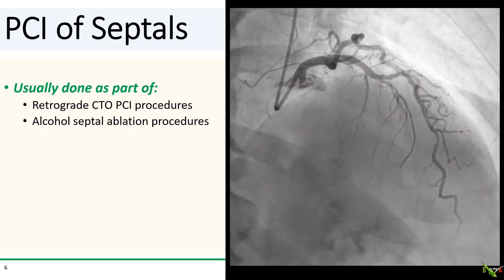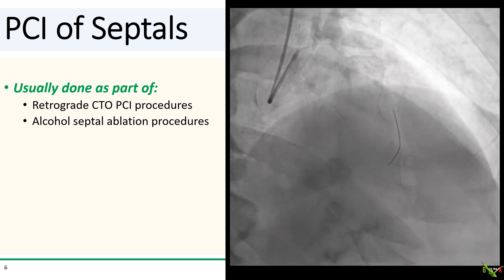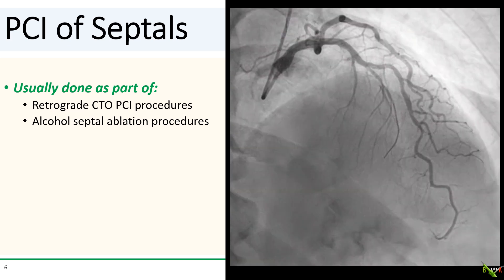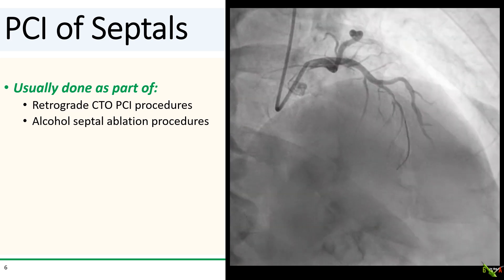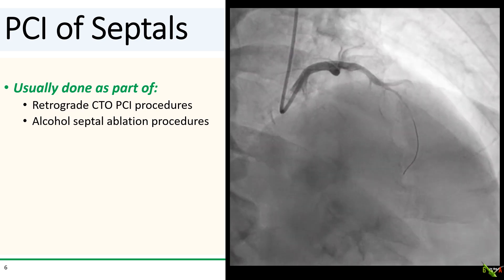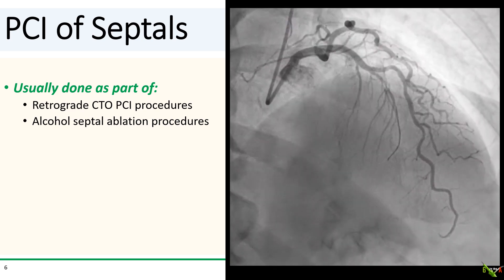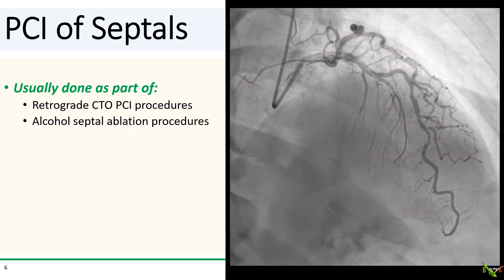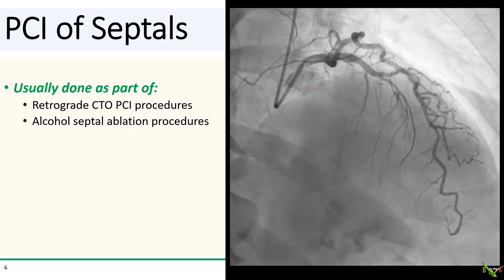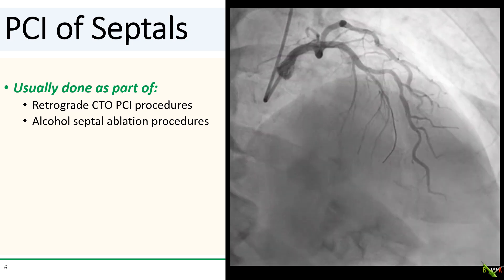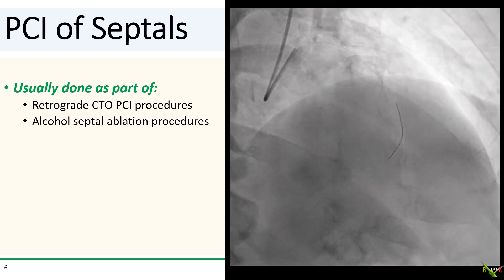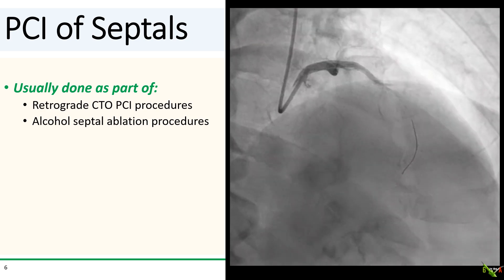PCI of septals is not often done, and when it is done, it's usually part of another procedure. In retrograde CTO-PCI procedures, sometimes you have to dilate the septal to get your retrograde gear through to the other side. In alcohol septal ablation procedures, you inflate a balloon into the septal before infusing alcohol, but your goal is to occlude the septal, not to open it.